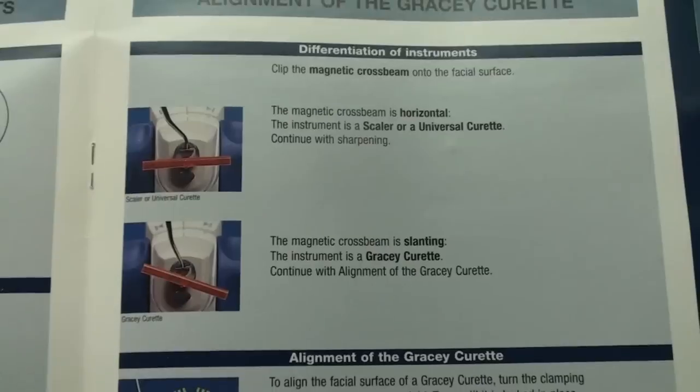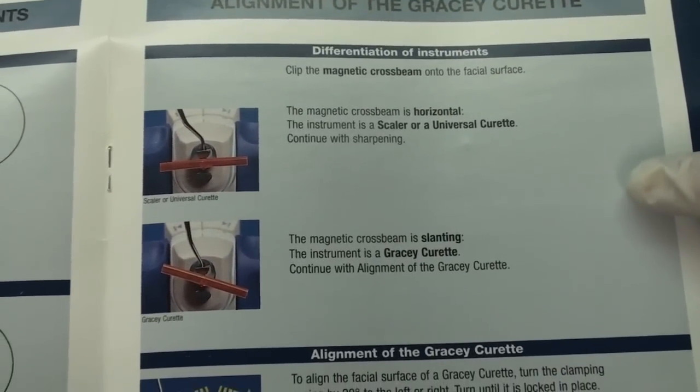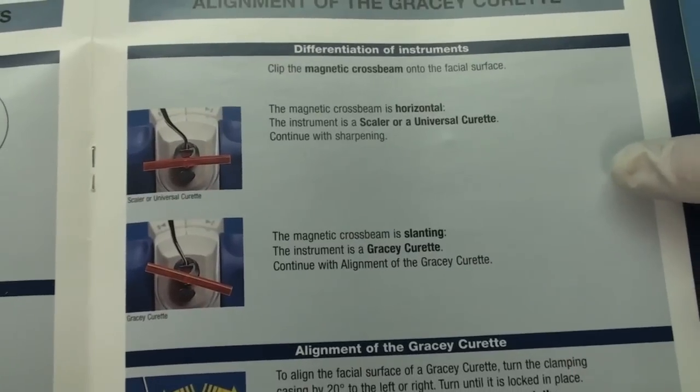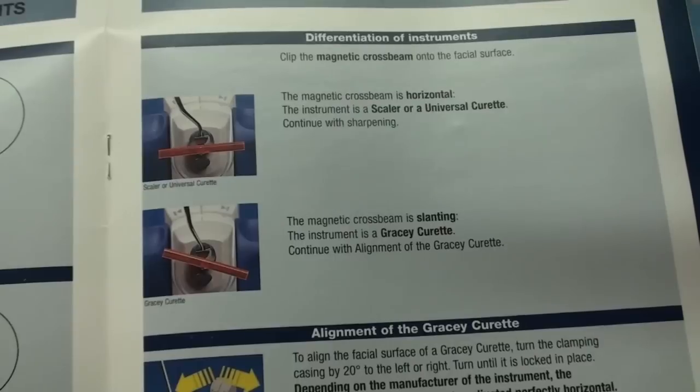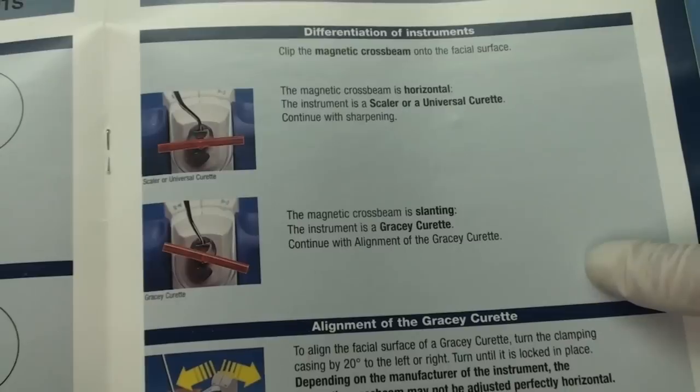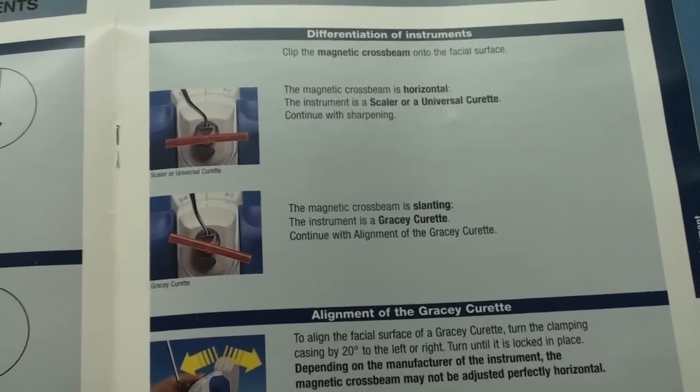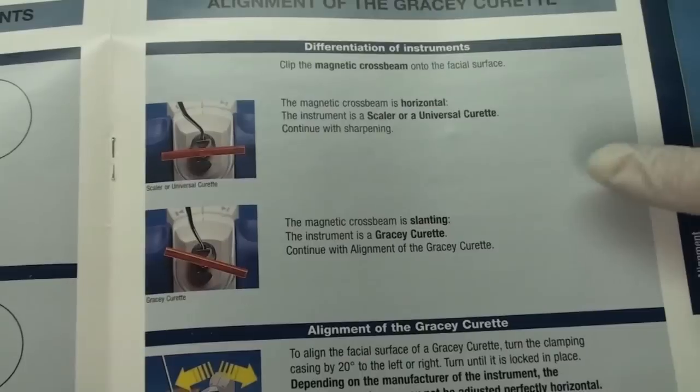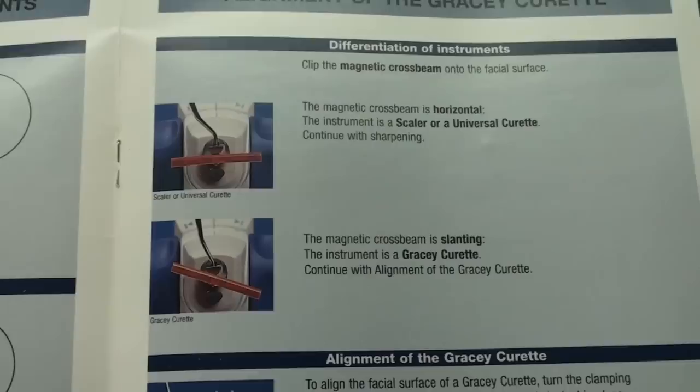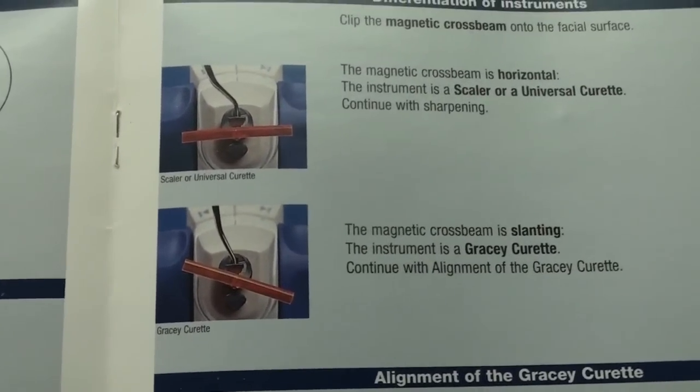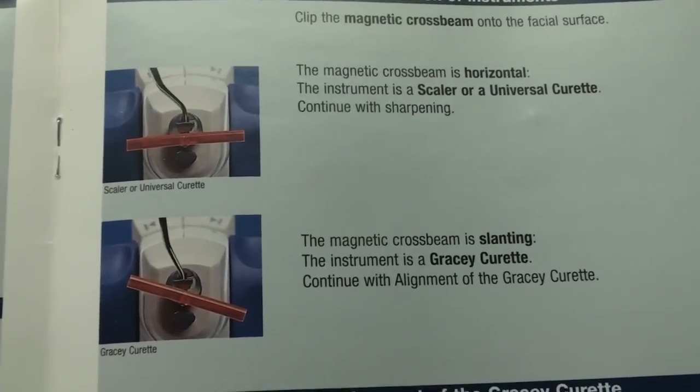Using the red magnet stick, it will show you which side of the instrument needs to be sharpened. We have the scalers or a universal curette where the red bar will be straight. And then when you get to your Gracey curettes, it will slant to which side the cutting edge is on. So that's a valuable tool because this way you could even have an assistant do this for you. Most of us hygienists all know which side is the cutting edge, so we don't really need this. But this is great for your hygiene assistants who can actually do the sharpening for you.